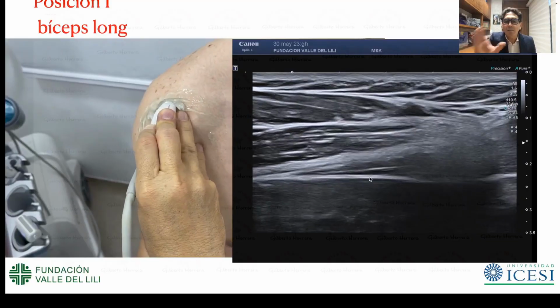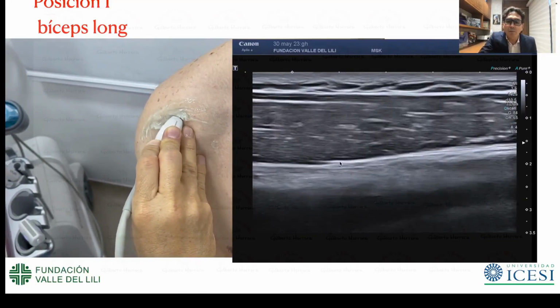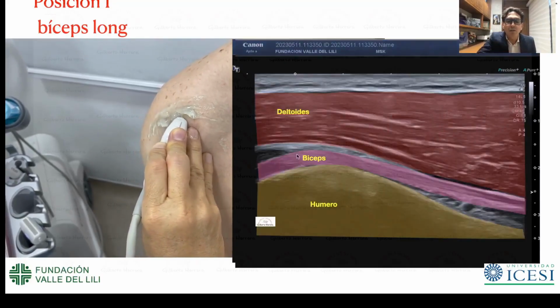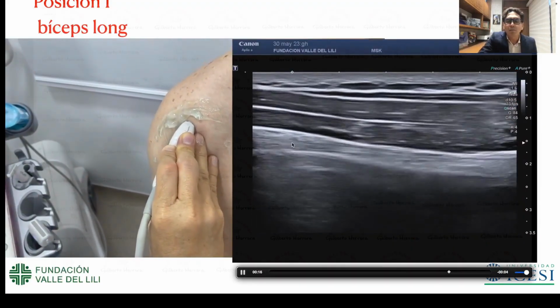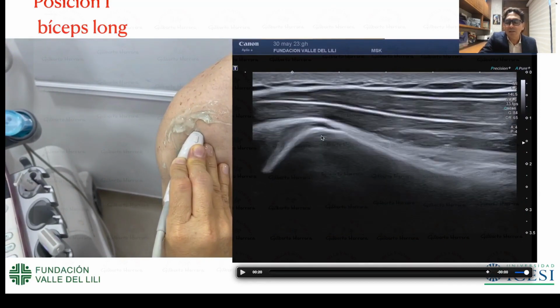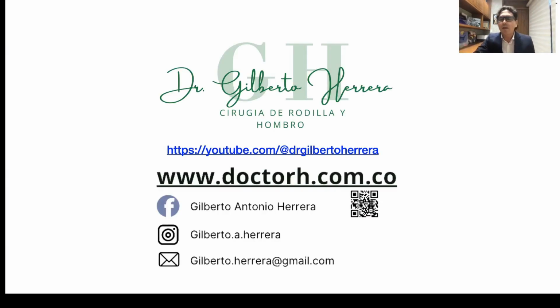This is very dynamic, so look, here's the origin, already from the muscular part and the distal part. And we keep following it, evaluating each of its details until it enters the joint, evaluating its thickness, the presence or absence of fluid. But for now, it's about identifying the normal anatomical pattern. Biceps, first structure, position 1, in the anterior part of the shoulder.